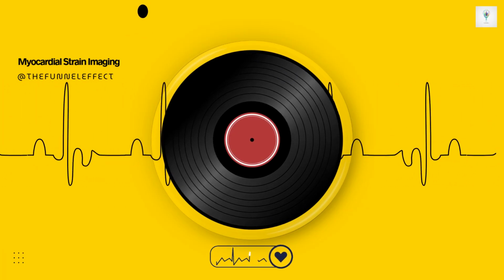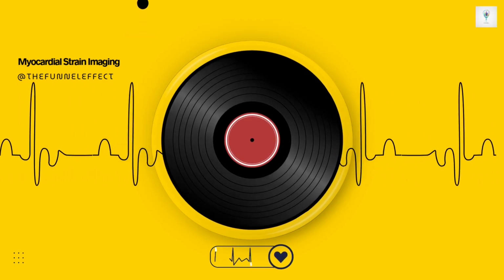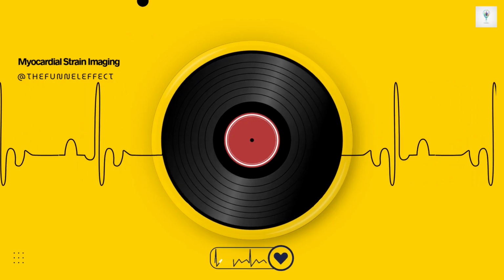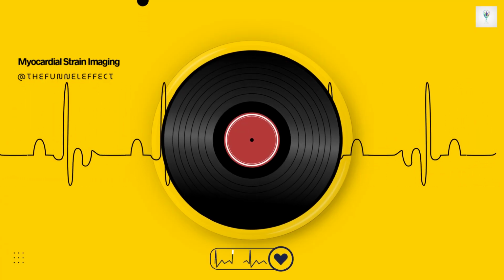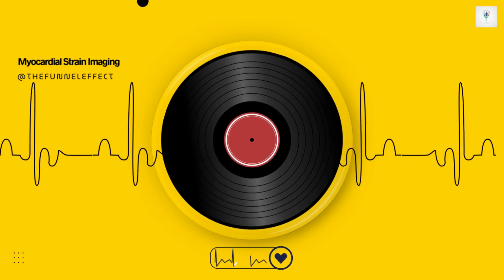What else could high frame rates enable? It would dramatically improve our ability to analyze those very short-lived cardiac events, like the isovolumic phases, and potentially make strain measurements during stress echocardiography much more robust and reliable. These technological advancements really promise to give us the kind of physiological clarity we've been seeking.